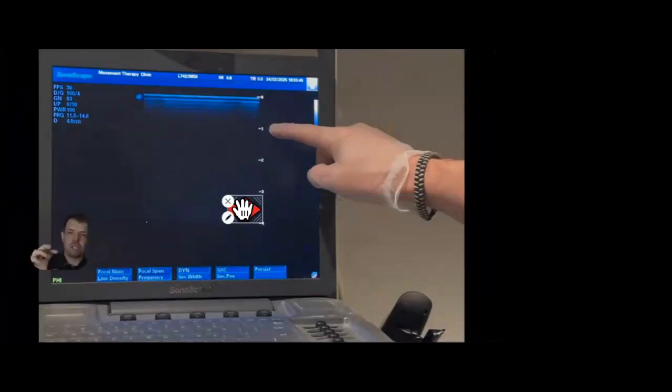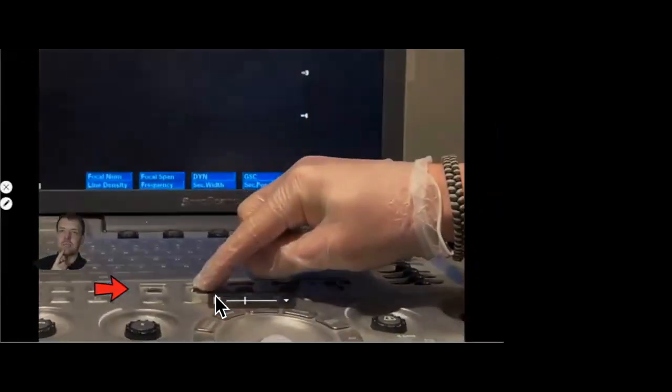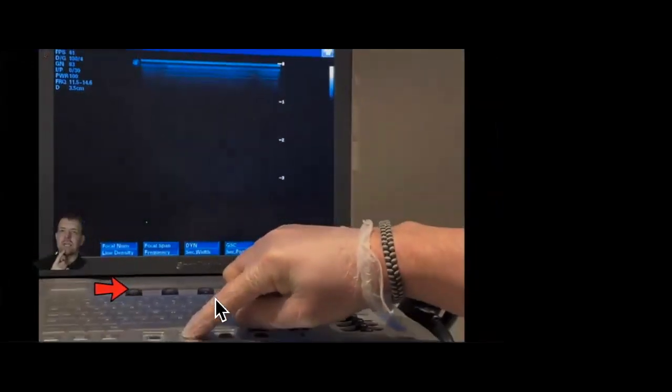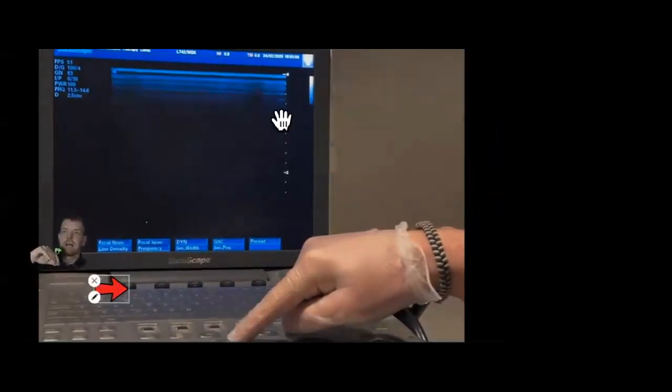Now, if you're imaging the Achilles tendon, the Achilles insertion, you don't need that amount of depth. So the machine will be trying to scan down that deep, but you'll be wasting the energy of the machine because really you want to focus on those top 2 centimeters. So what you can do is there is a button on here, I'll just show you in a sec on mine. So those are the depths, and then there's the button there. And as I flick it, it will decrease the depth. So now on the side of the machine, I've got 0, 1, and 2. So I'm just asking the machine to concentrate on those top 2 centimeters.